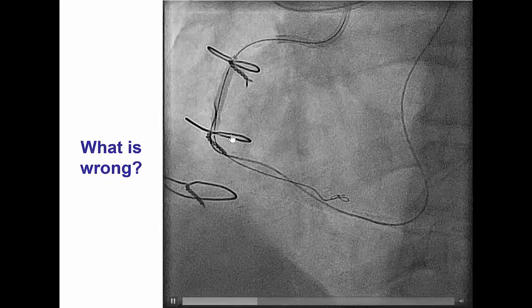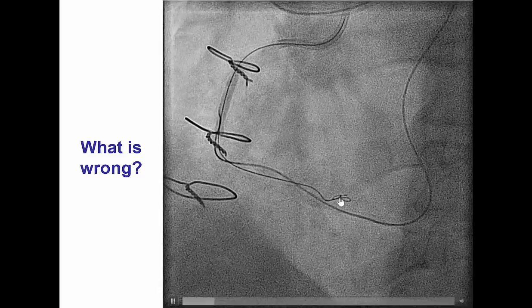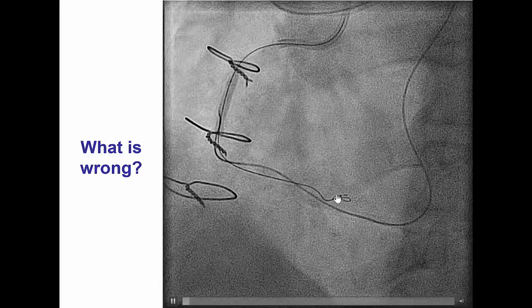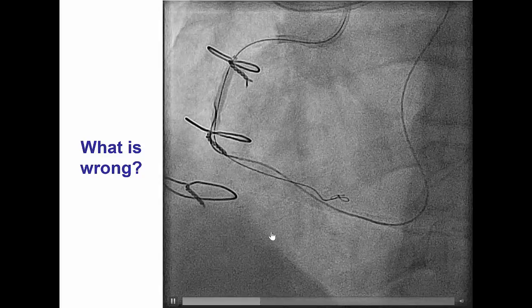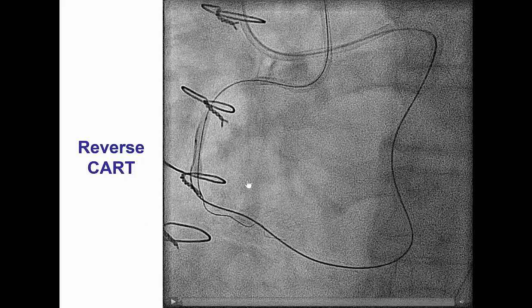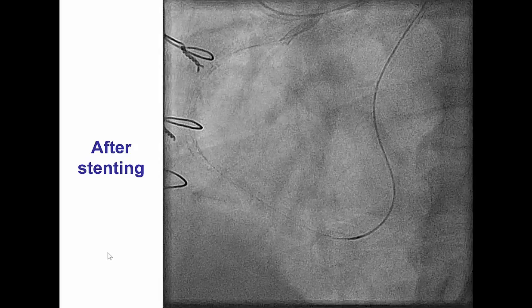During those attempts, the antegrade wire appeared to go into a small branch, which we didn't really pay much attention to at the time, but that would become relevant later. We were then able to perform the reverse CART and advance the retrograde guide wire into the antegrade guide catheter and externalize it.